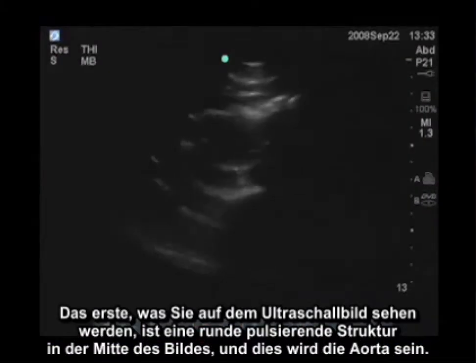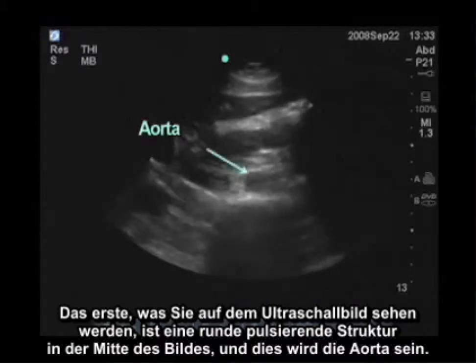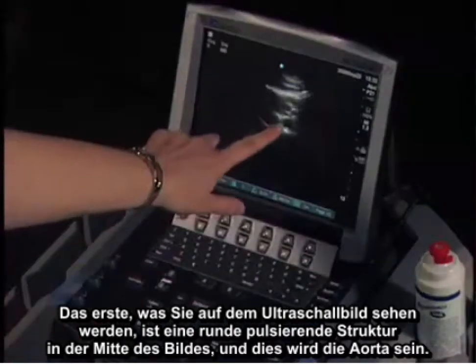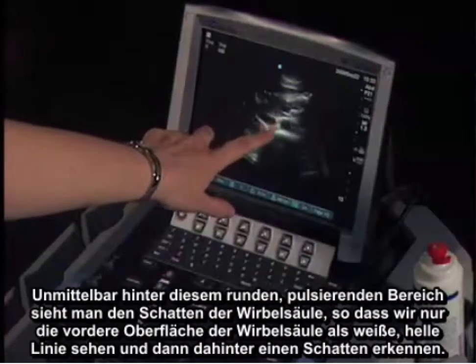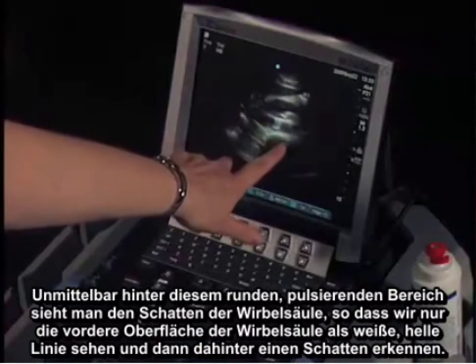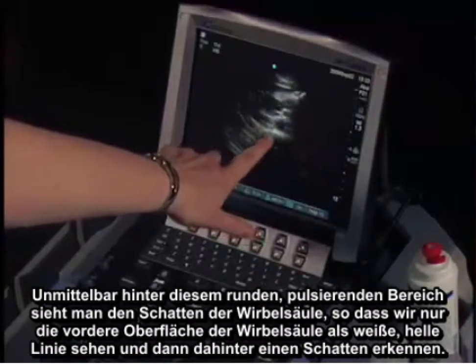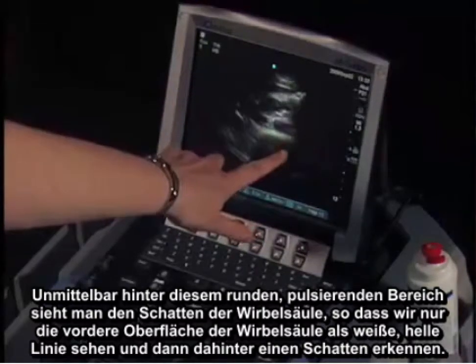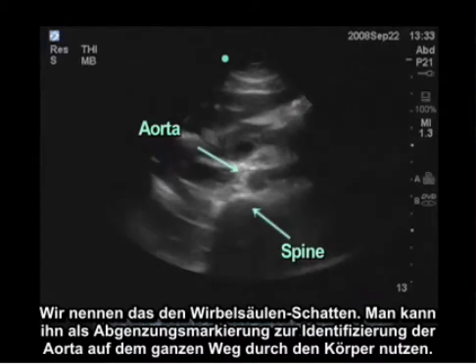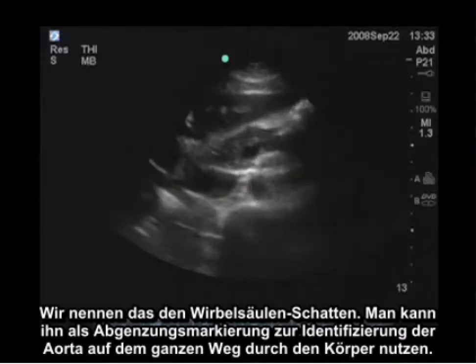The first thing you're going to see on the ultrasound image is a round pulsating structure in the middle of the image — this will be the aorta. Immediately posterior to this round pulsating area will be the shadow of the spine. We see the anterior surface of the spine as a bright white line, and behind it is the spine shadow, which you can use as your landmark to identify the aorta all the way down the body.